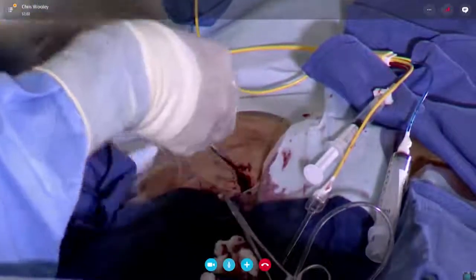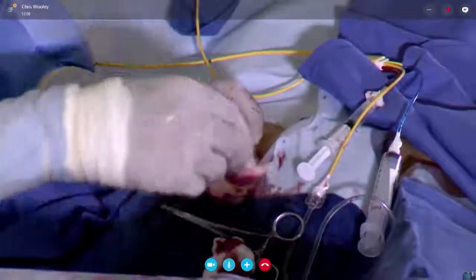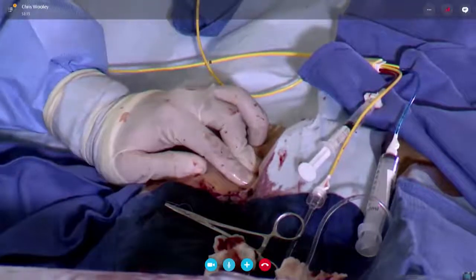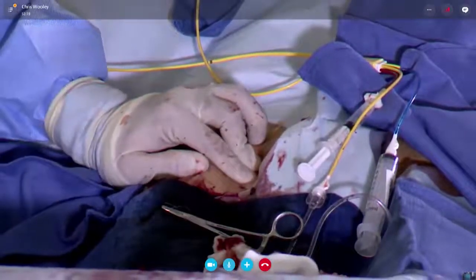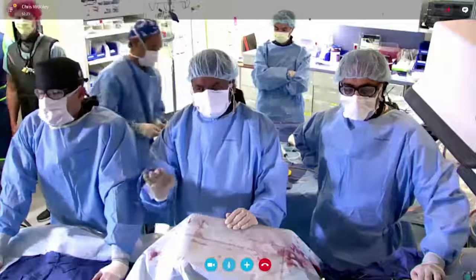Patients usually sit up in 4 hours. We do not send the patients to the intensive care unit because they are better than what they came in. So they usually are sent to the floor in a telemetry unit. And all that we monitor is that there's no bleeding, as you can see, in this entire procedure. So we only check the creatinine the next morning. We don't need any contrast. There is no contrast. There's minimum blood loss.